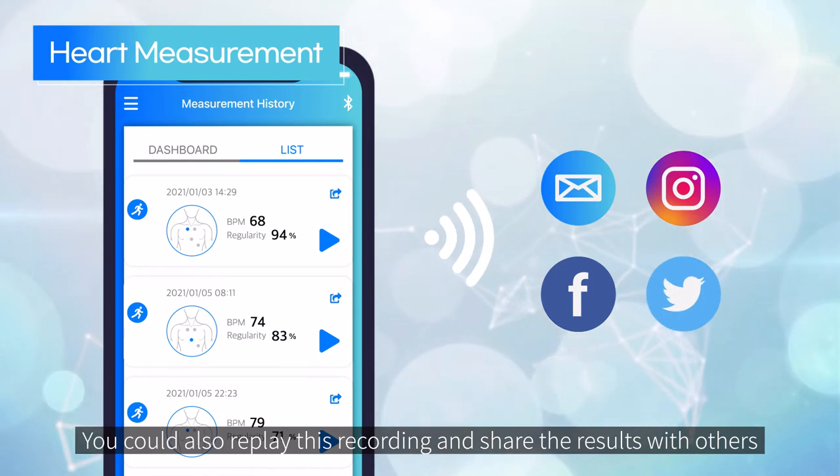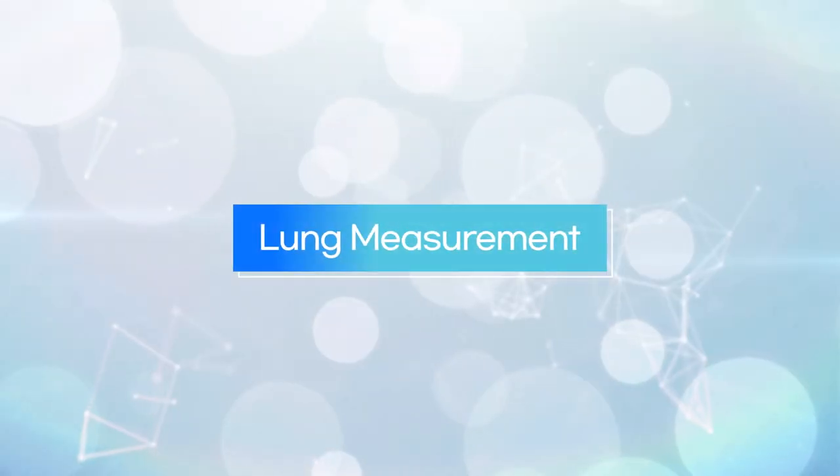After the measurement, the app will direct you to the results page where you will find your BPM, heart regularity, and decibel reading. You can also replay this recording and share the results with others.